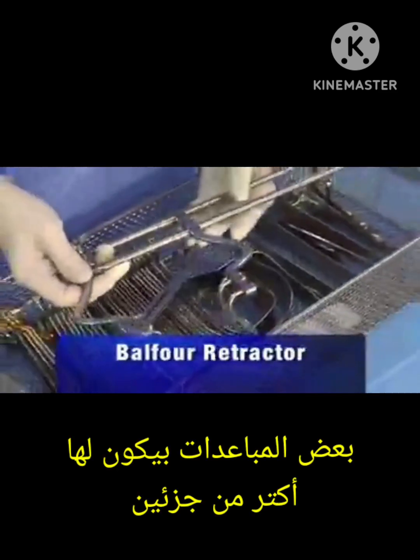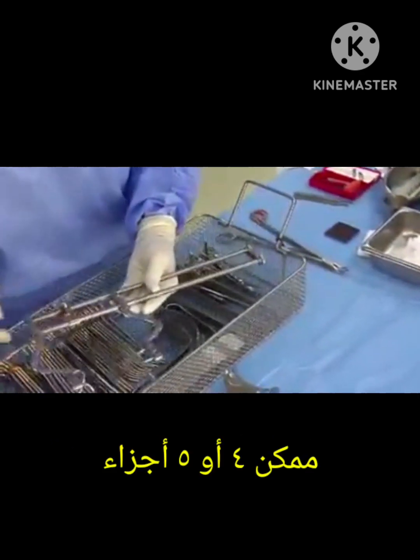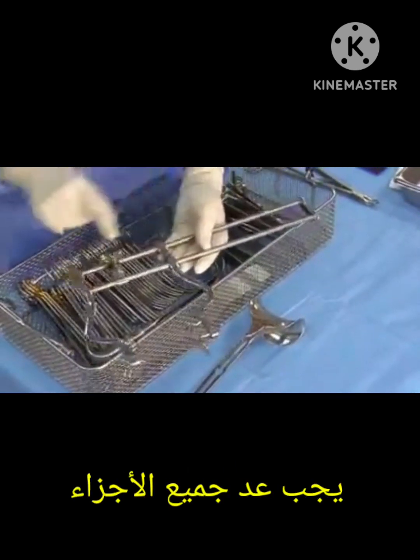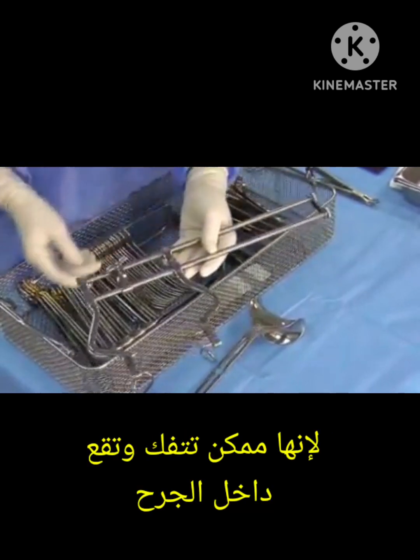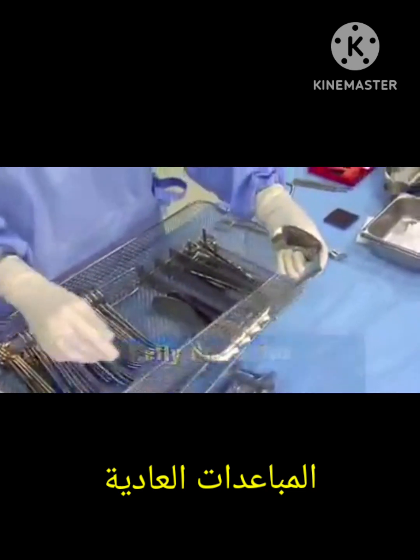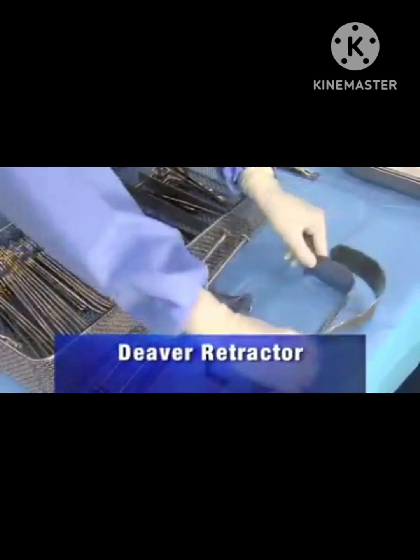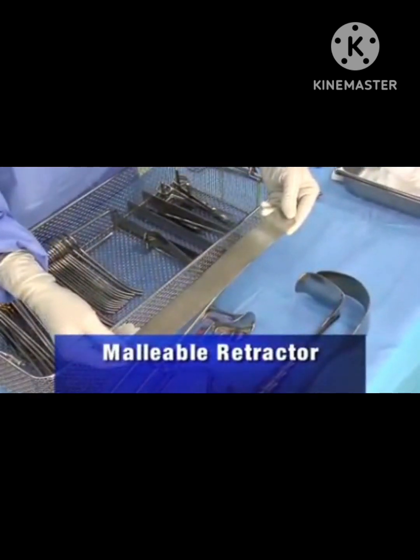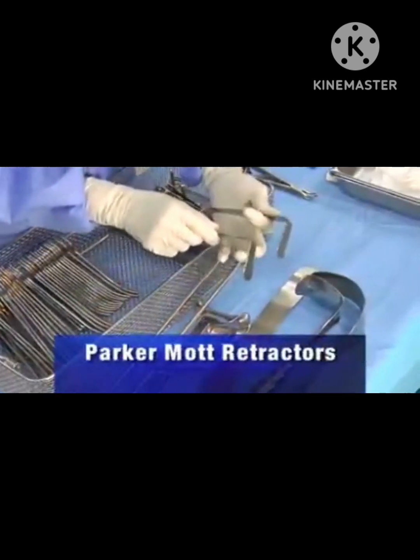Never move instruments out of the pan until they have been counted. Scalpel handles: one, two. The Balfour retractor is another example of a multi-piece instrument — count one blade, four pieces, and three screws separately.